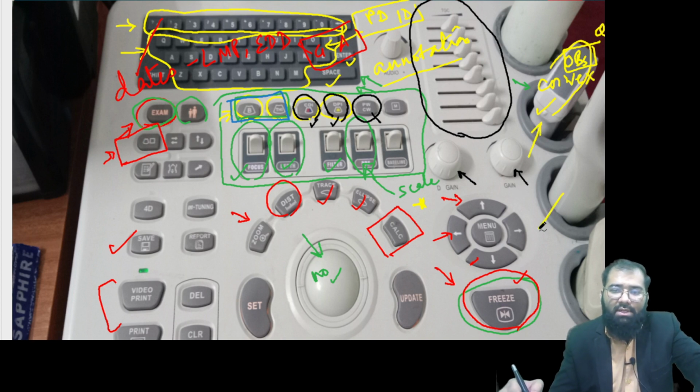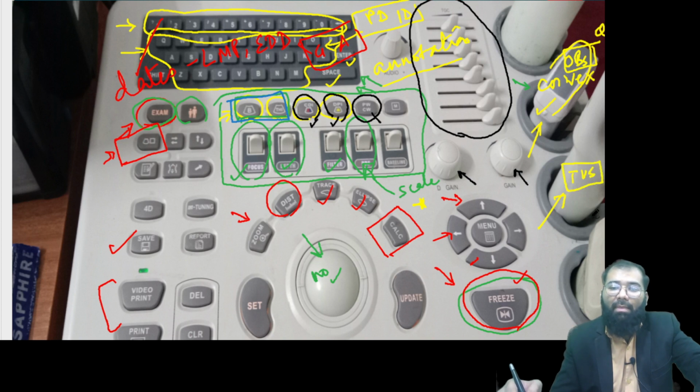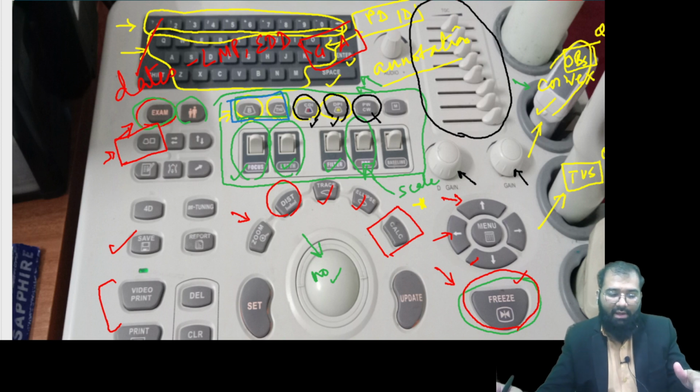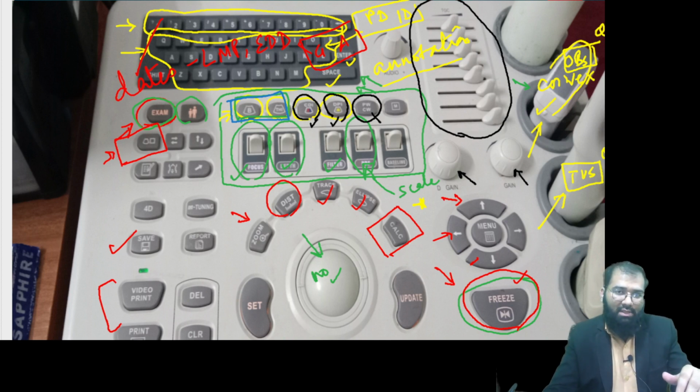Okay. Now this is the transvaginal probe or the TVS probe. Now remember that in case of early gestation, if you see my lectures on early pregnancy failure, in case of how to diagnose pregnancy early, and in case of all gynecological disorders, so all pelvic pathologies, we advocate transvaginal ultrasonography. Now if you see my series of lectures, there is one more lecture where I have said even in advanced gestation when to go for TVS, when you want to measure the cervical length with accuracy, imaging cervix.